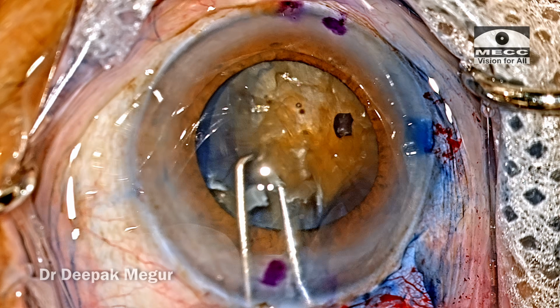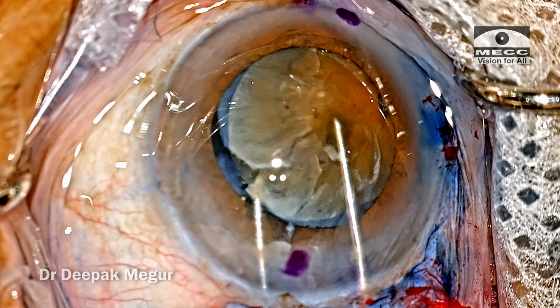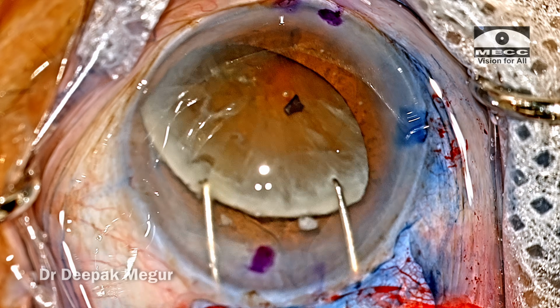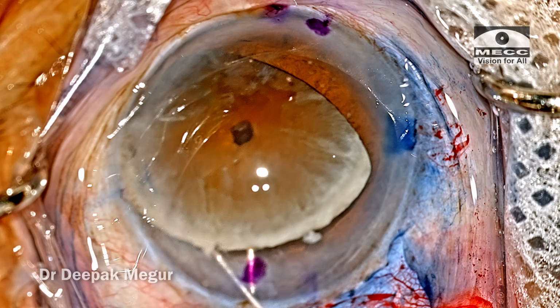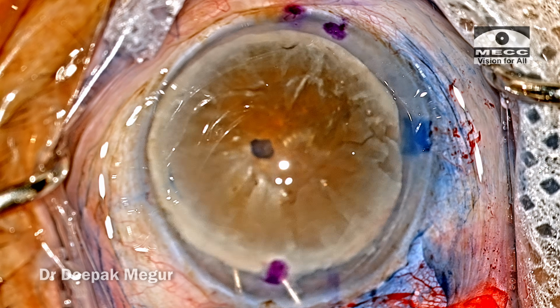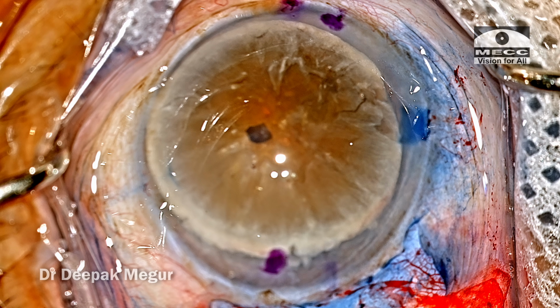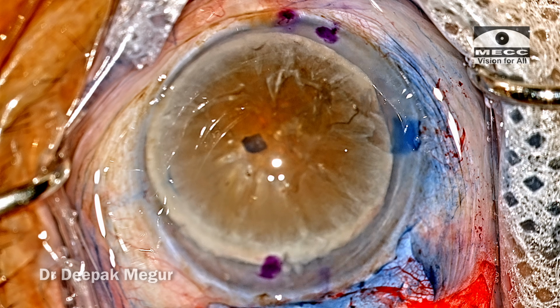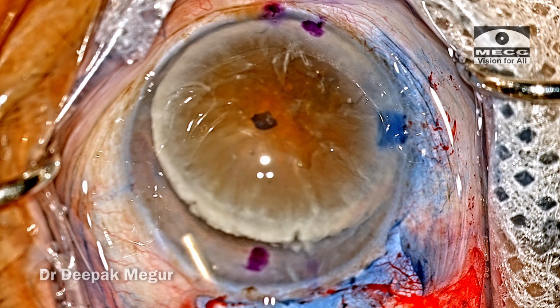The dialer goes in and hooks the equator under the surface of the nucleus, and then the other one just rotates or wheels the nucleus out of the bag. So now we have the entire large brown nucleus in the antechamber. Again, I was very generous with my wound construction simply because I was expecting this large and bulky nucleus.